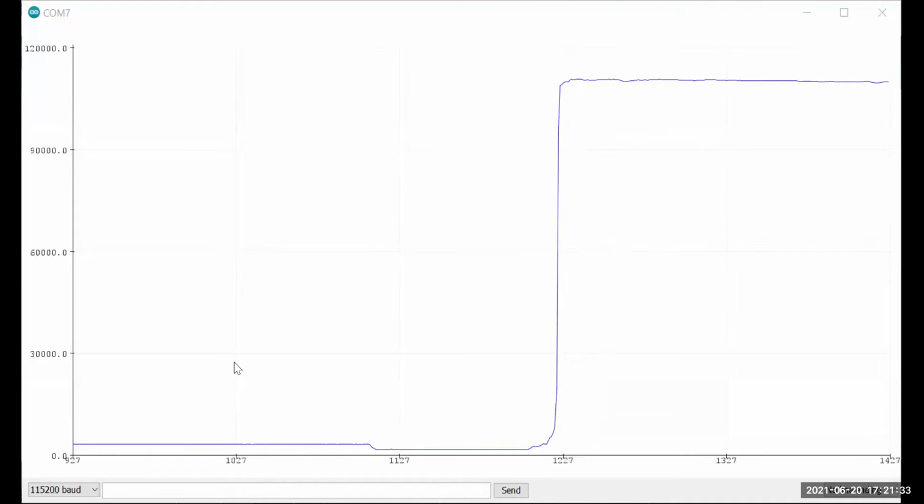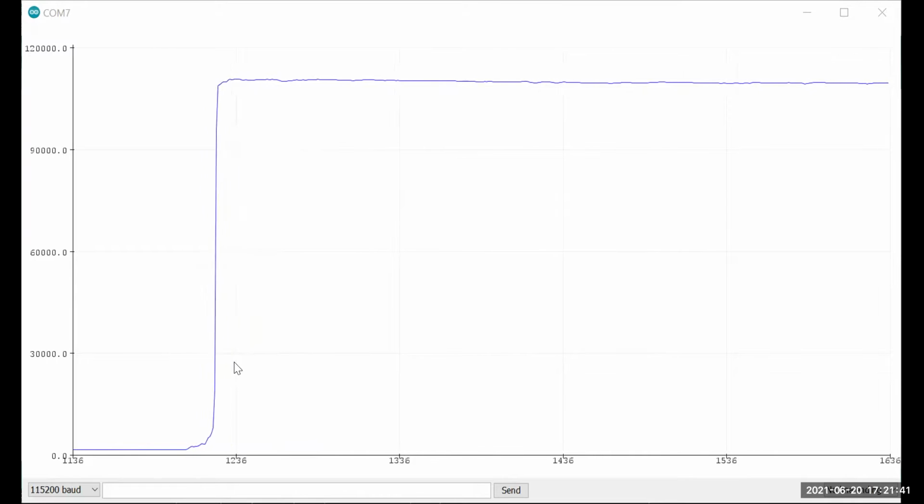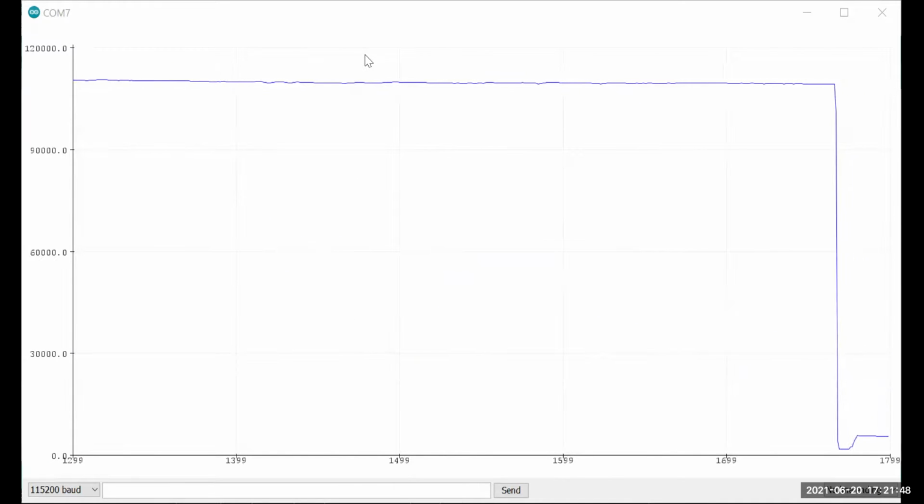So if I take 500 samples to start off, note it's almost done taking 500 samples, it'll be able to auto scale to about what your values are. So I need to populate the graph with 500 values, so this happens. And that was just a workaround. I brainstormed for a while to figure that out.